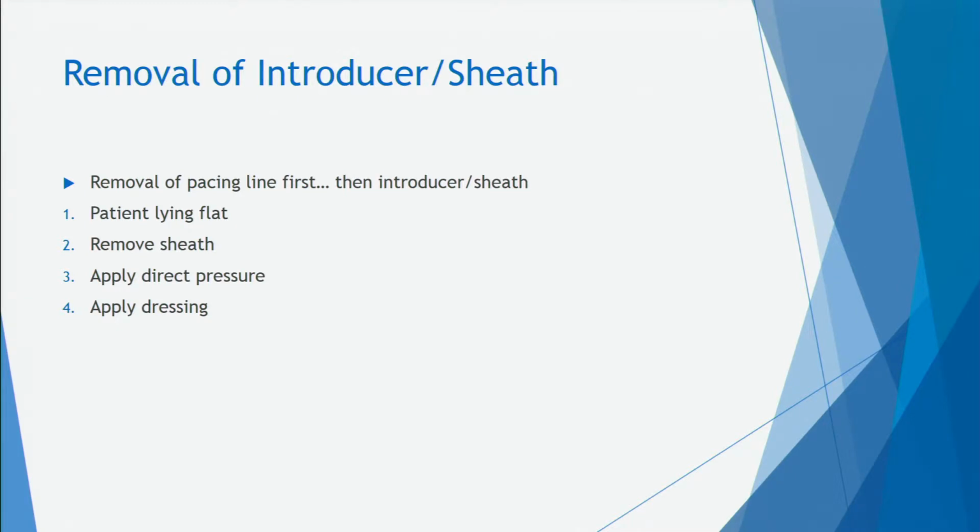Yes, sir? Right now, the policy states that we can't remove a cordis. A cordis? Because we have to get anesthesia to come and take it out before we take the patient. Really? Okay, I'll have to talk to Damon. I mean, it's smaller than a cordis. I think for right now, you're going to follow your unit policy. Right. I think as the phases progress, the idea is for you guys to do more and more. Right now, in phase 1, you won't even have these, but eventually you should be able to remove them.